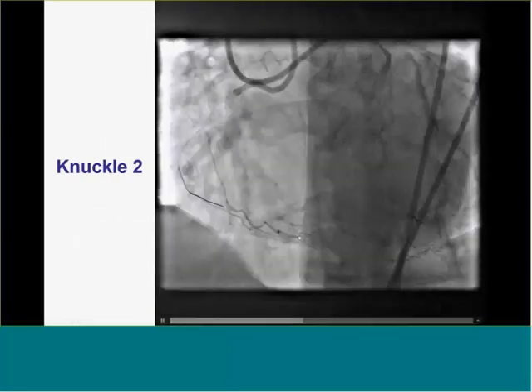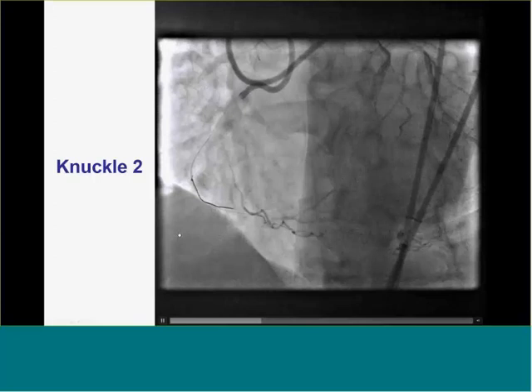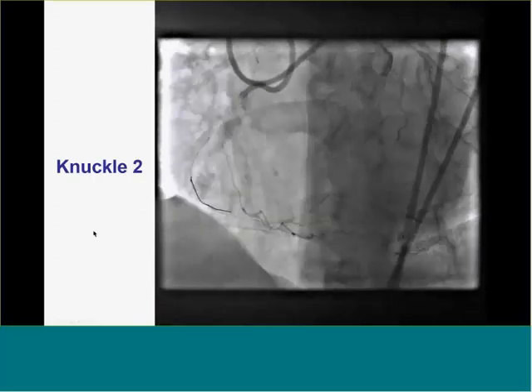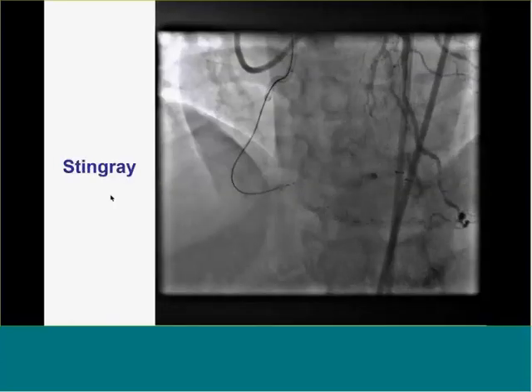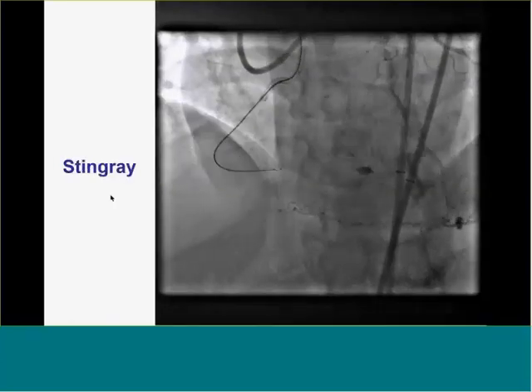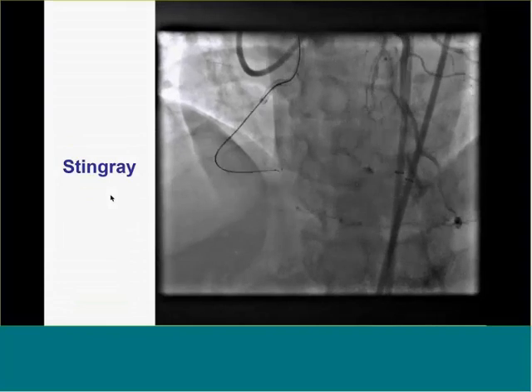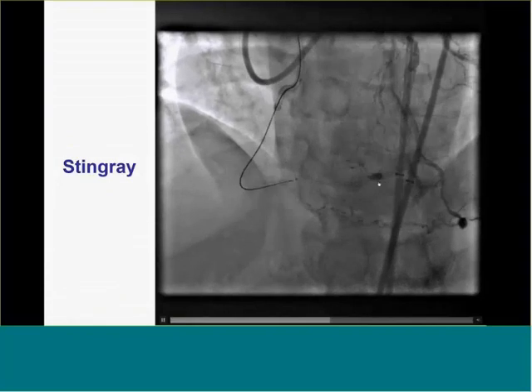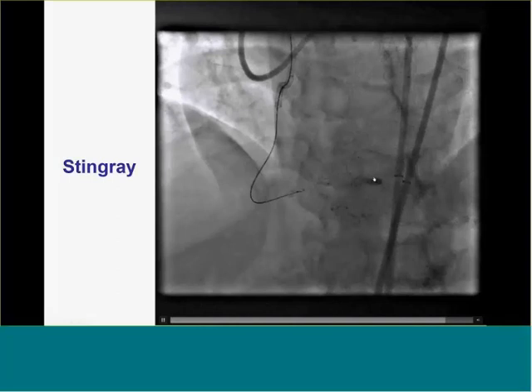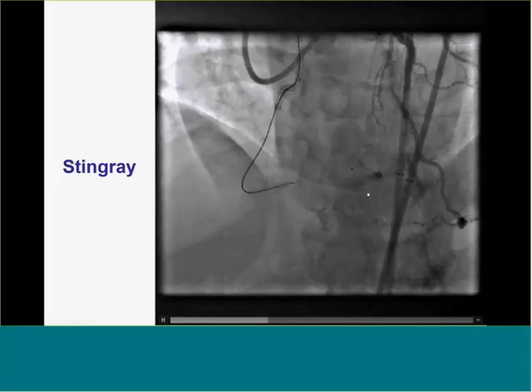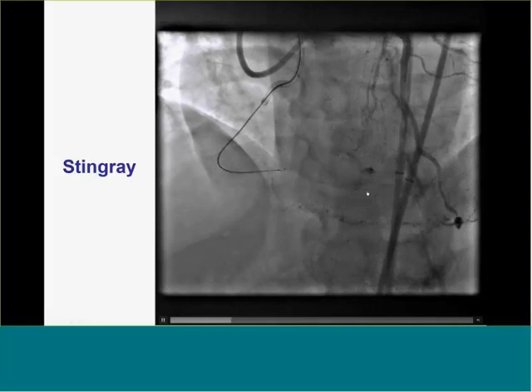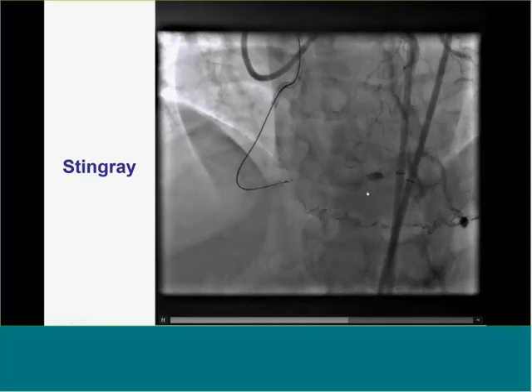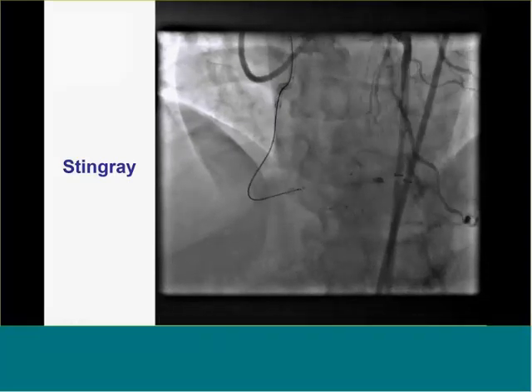Making progress, moving towards the vessel. We're close to the posterolateral branch. There's a little bit of stain into the septum, which is not a big deal. There are some case reports of hematomas compressing the septum, but here it doesn't look too bad.